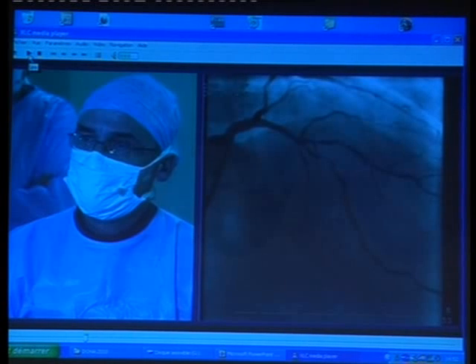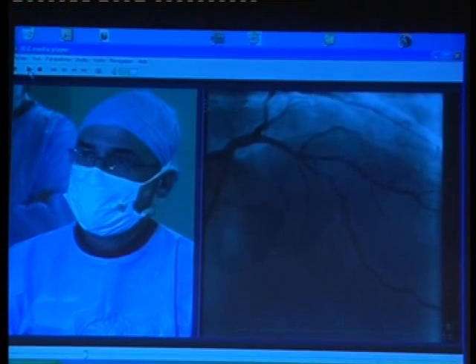The question that comes to mind, and I think you could see the circumflex also: from the audience, just a simple vote here, who would think this patient will need 2 stents versus one stent? Who says 1 stent for this bifurcation? Who says 2 stents? More. So we have a majority of people saying 2 stents, and I would say 2 stents also, but let's see.